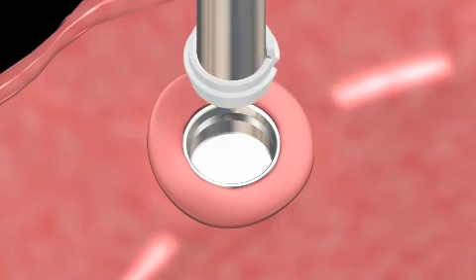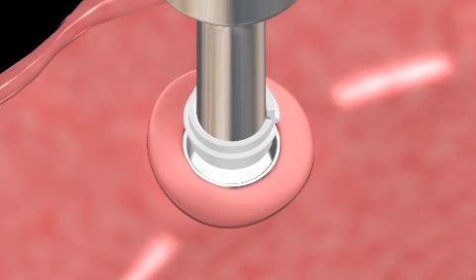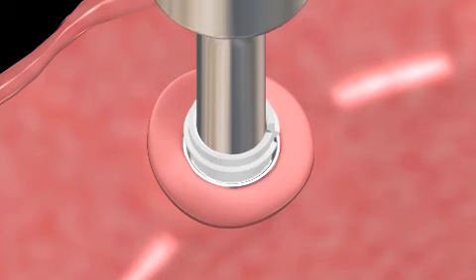Place the white ERA overdenture males on the ERA seating tool and snap them into the metal jackets.